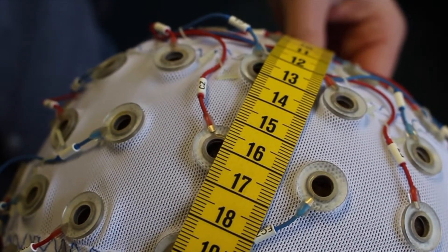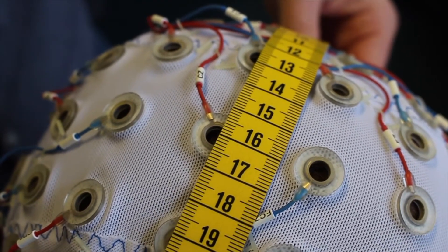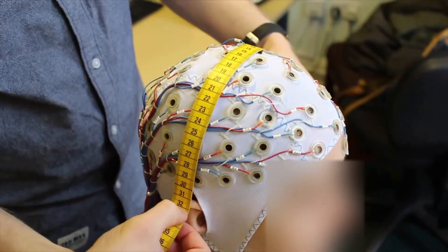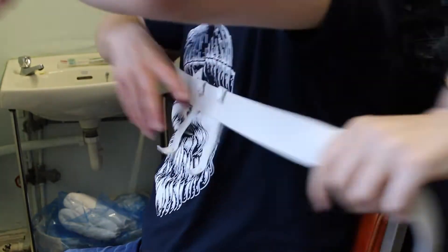Adjust the cap if necessary, however if the placement of the cap does not allow any space on the forehead, consider either a smaller cap or shift the cap back slightly. It might also be helpful here to get a second opinion on the fit if you are unsure.